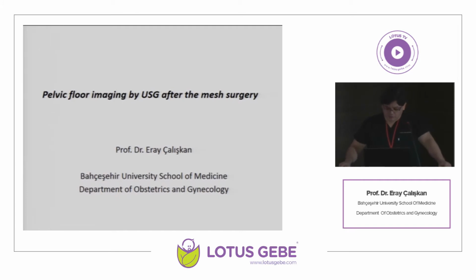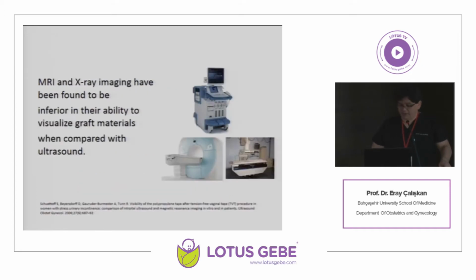Maybe you should do more research on who needs mesh surgery and who doesn't need. So we have our young colleagues, they can do the study. It has been shown that MRI and X-ray are not very effective in visualizing the graft materials compared to ultrasound.